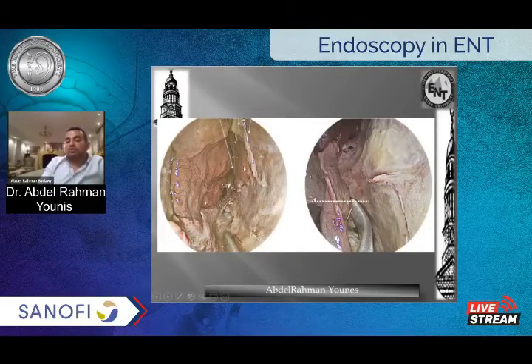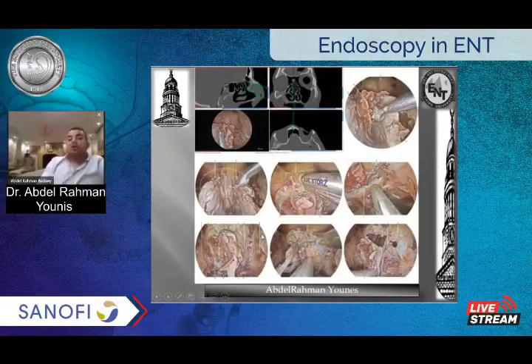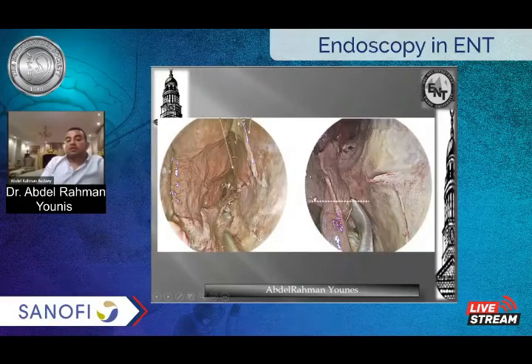You start to cut your nasal septal flap from the opening of the sphenopalatine foramen upward to the caudal end of the nasal septum. You can extend the Hadad flap down to the floor of the nasal cavity. All this area depends on this pedicle.